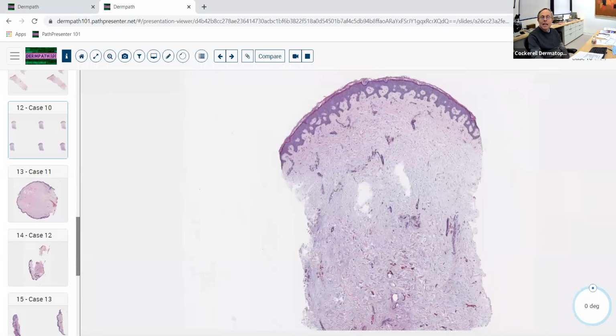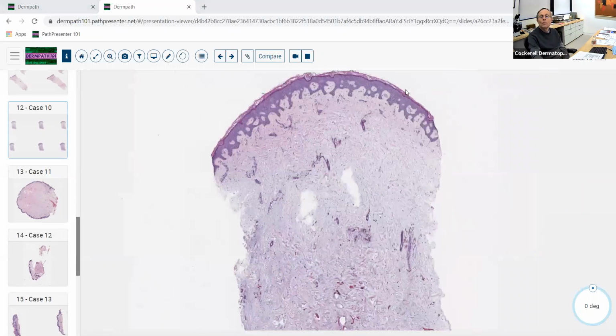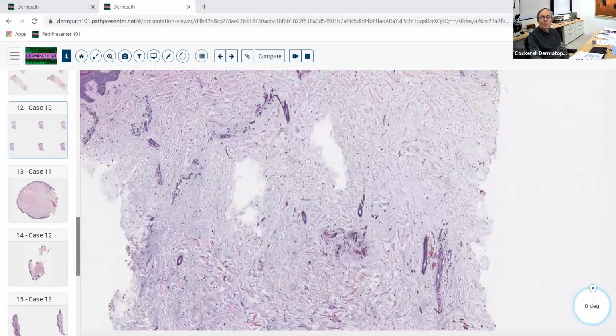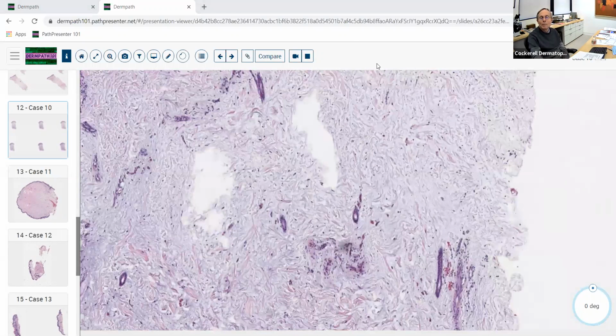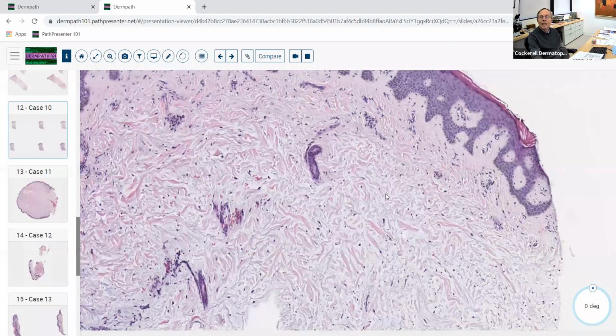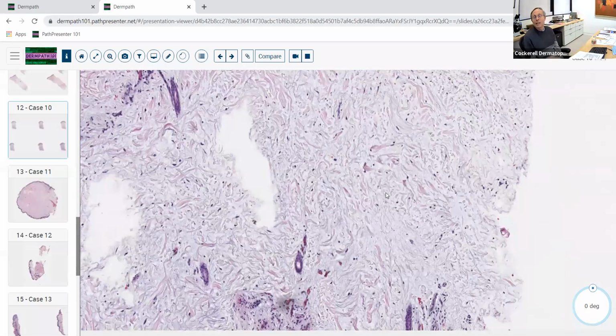And this actually was taken from an area where there's some dilated blood vessels superficially, maybe a little bit of stasis altered blood vessels up here. So this is an example of pre-tibial myxedema. And again, the myxedema just basically means a collection of mucin. So anytime you get massive quantities of mucin, it can look like this.